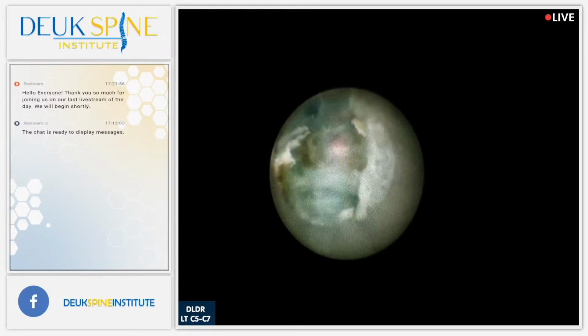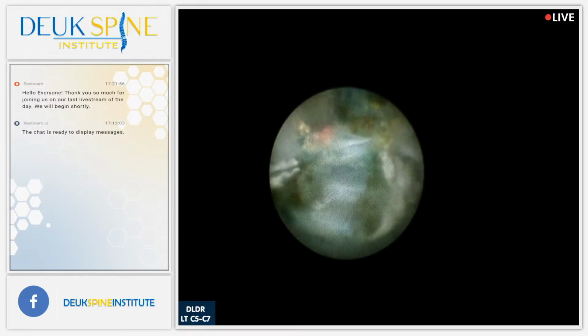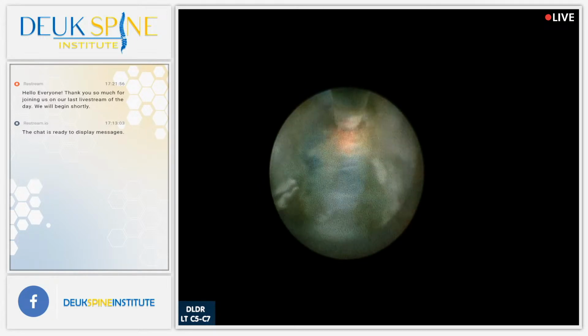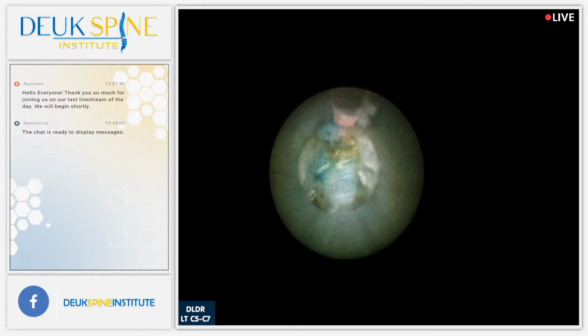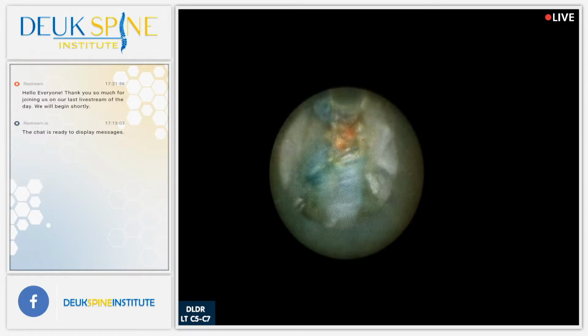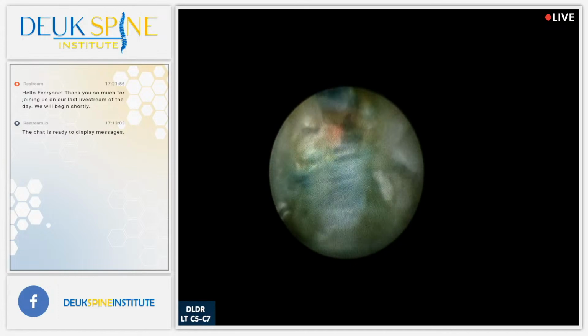We just keep going back and forth, working our way slowly sideways, using the laser to remove just the herniation and clean the tear through which the herniation exited, right? Because you can't have a herniation without a tear in the wall of the disc. We call those tears annular tears. And that's what she has. She's got an annular tear at 6-7 and 5-6.